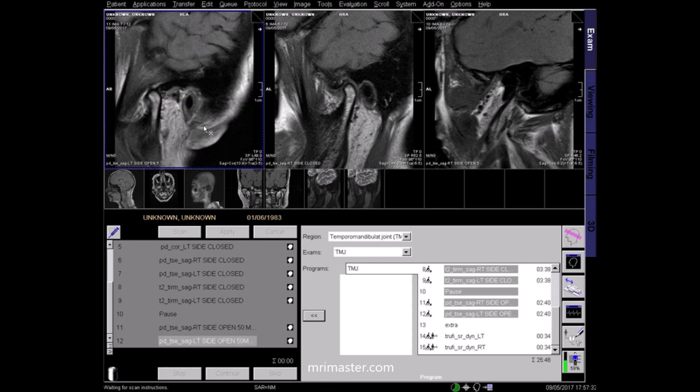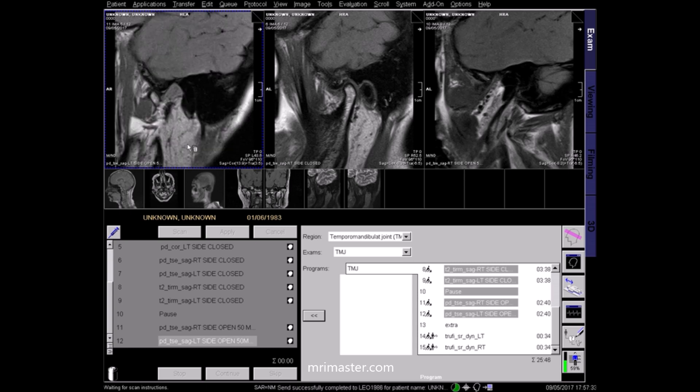Again, check that the image quality of the final images is satisfactory.